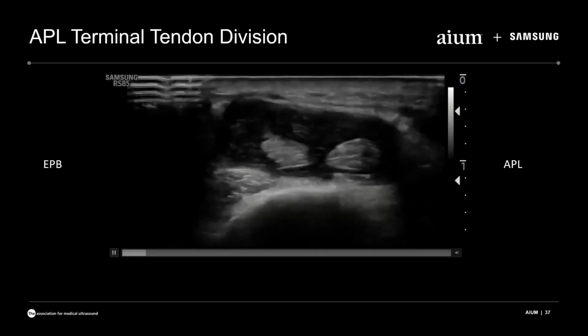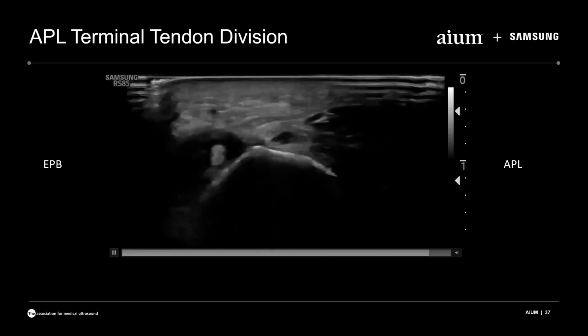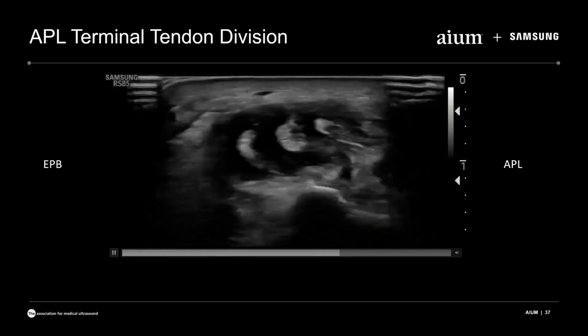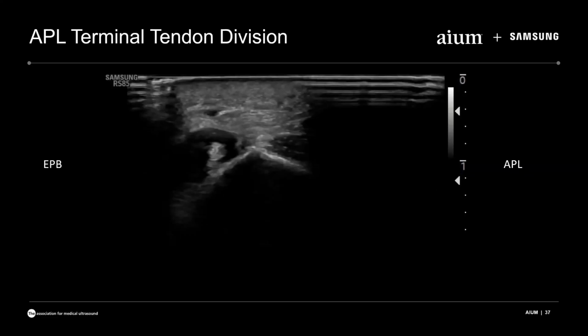And the way you can differentiate this from a split tear is that a split tear should rejoin the original tendon if it was truly a split tear, but instead it branches off. And often these variants become more pronounced when there is tenosynovitis because the tendon sheath is distended and it makes all the tendons much more conspicuous. So it's a pitfall, and it's one of those challenges when you're first learning MSK ultrasound to be aware of.